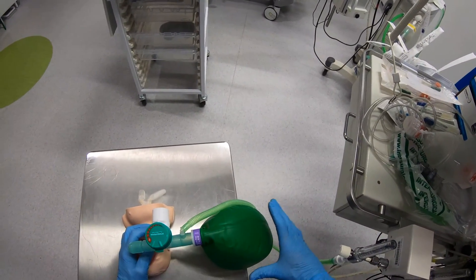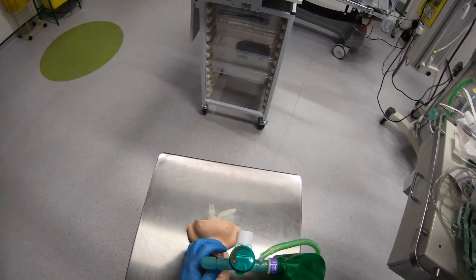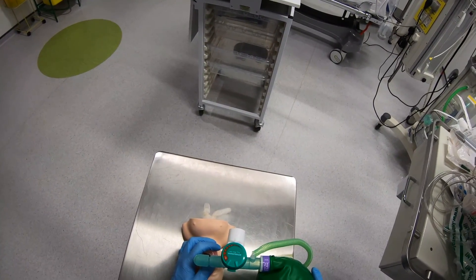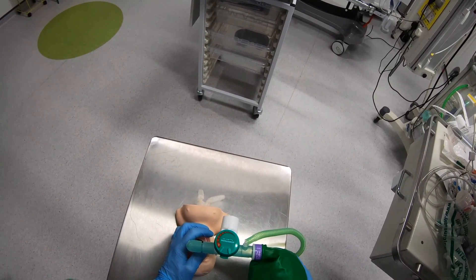Somewhere in the middle is about right. All the time I'm looking at my patient, checking that I'm moving the chest just as much as I want and not squeezing the bag excessively.